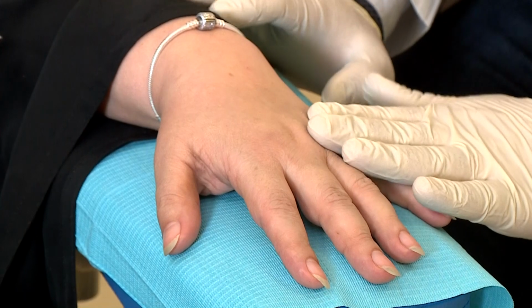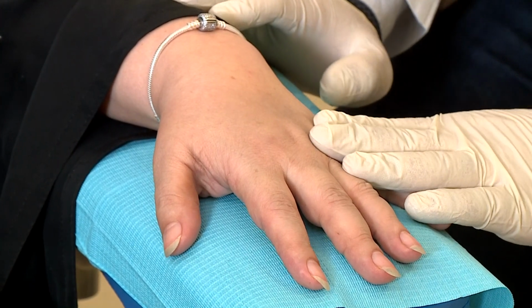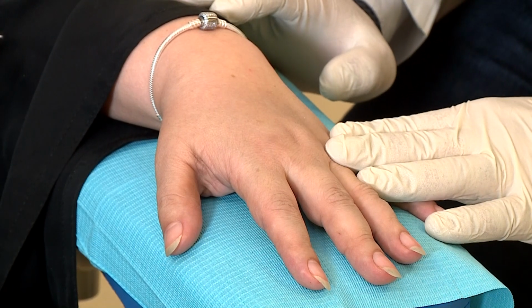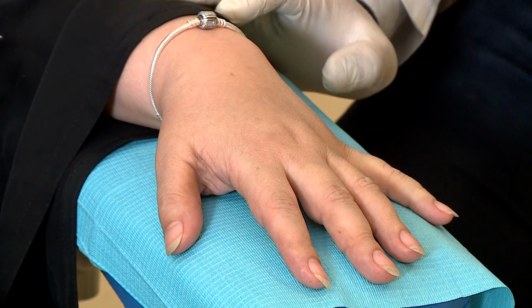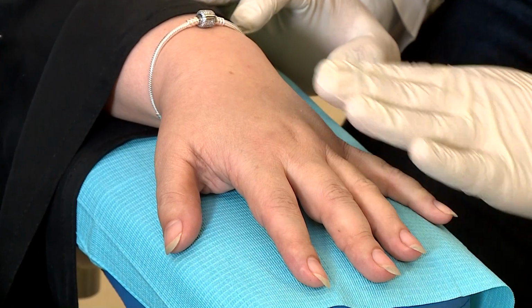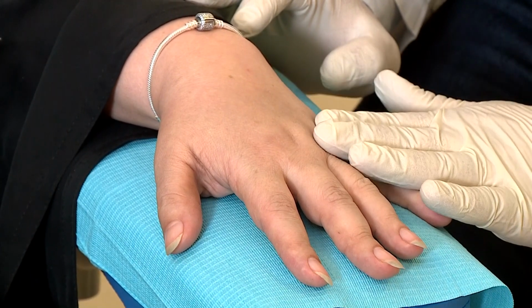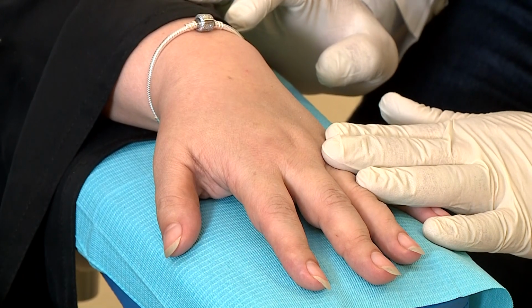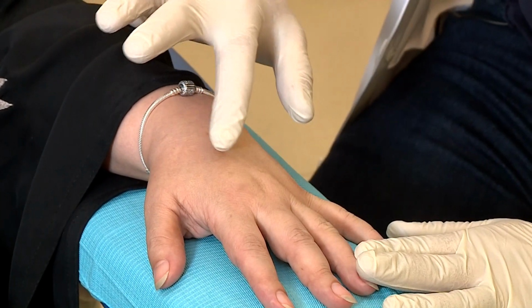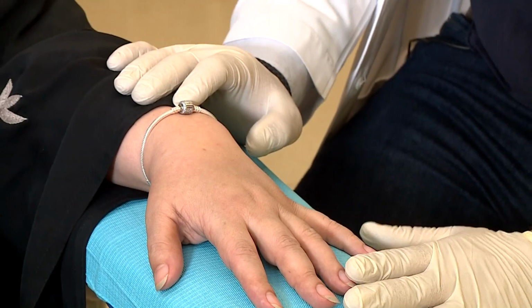Okay, Bismillah, and we have this beautiful lady here. She's not exactly what most patients are looking for in a hand filler. She has quite full hands, but at the same time, a little bit of rejuvenation for the hand using Radiesse will make the hands look more beautiful, especially at the areas where she has a little bit of wasting.